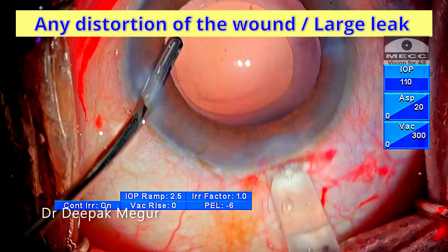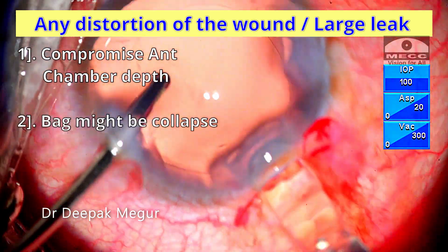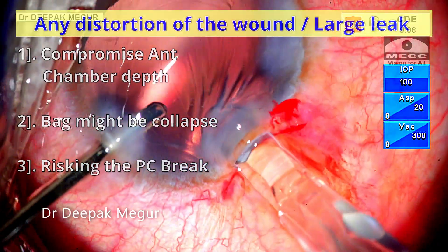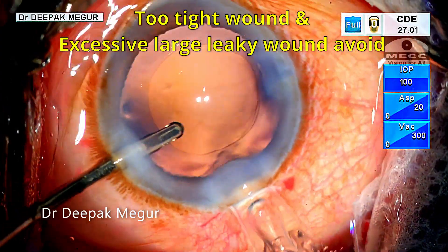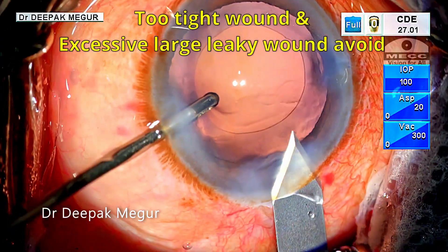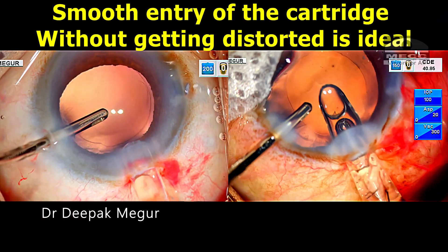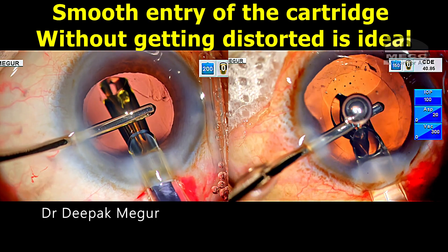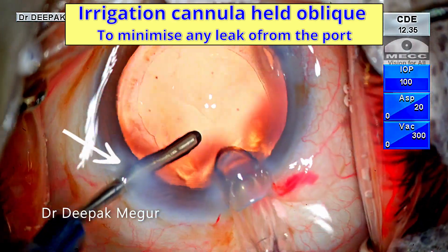Any distortion of the wound or large leak can compromise the anterior chamber depth, and the bag might collapse, risking complications like posterior capsular break. A too-tight wound that gets distorted during forceful entry of the cartridge, and excessively large leaky incisions, have to be avoided. An incision which allows smooth entry of the cartridge without distortion is ideal. The irrigation cannula can be held obliquely to minimize any leak from the port.